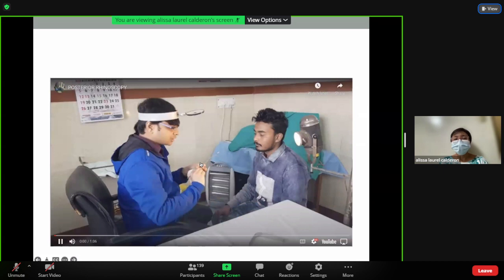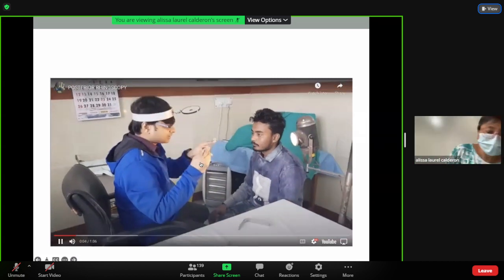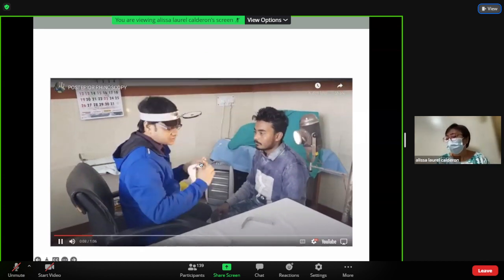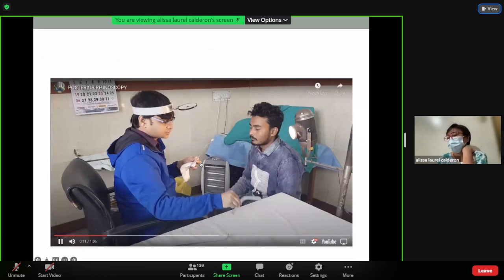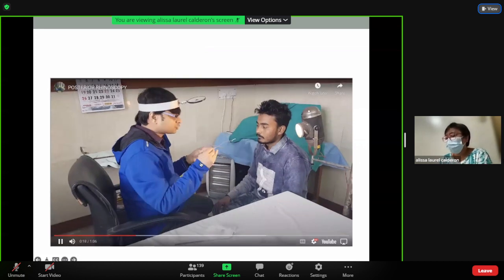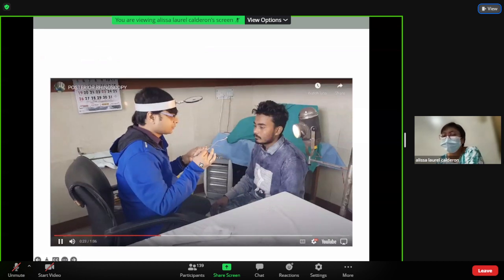For posterior rhinoscopy, we use the posterior rhinoscopic mirror. This mirror is slightly curved, with an angle of 120 to 130 degrees. The second instrument used in posterior rhinoscopy is the tongue depressor. We depress the tongue with the help of the tongue depressor, and the mirror is introduced in the oral cavity to examine the nasopharynx, the posterior part of the nasal cavity.